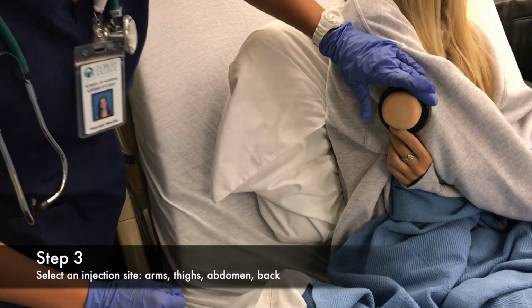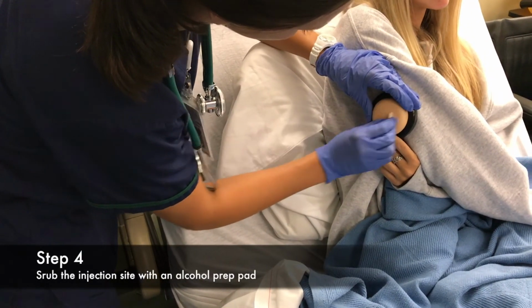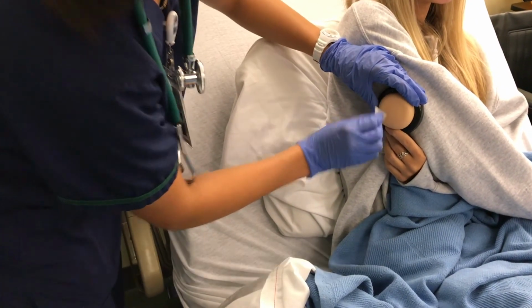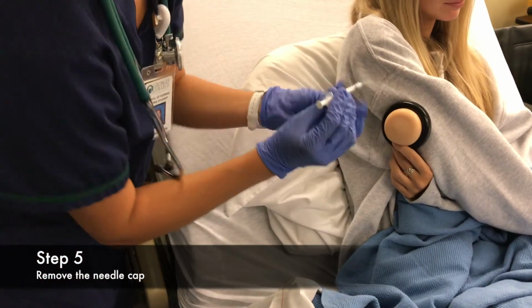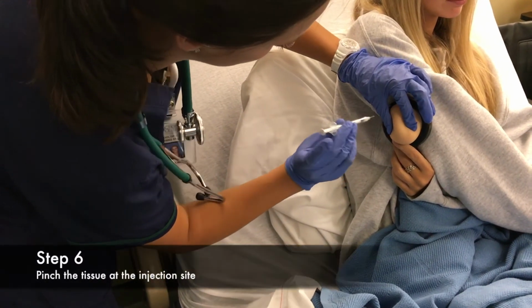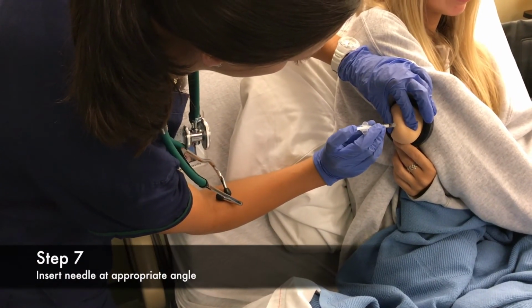Select an injection site. Scrub the injection site with an alcohol prep pad. Remove the needle cap. With your non-dominant hand, pinch the tissue at the injection site and determine the angle at which to inject the needle. Holding the syringe between thumb and index finger of your dominant hand, insert the needle at the appropriate angle.